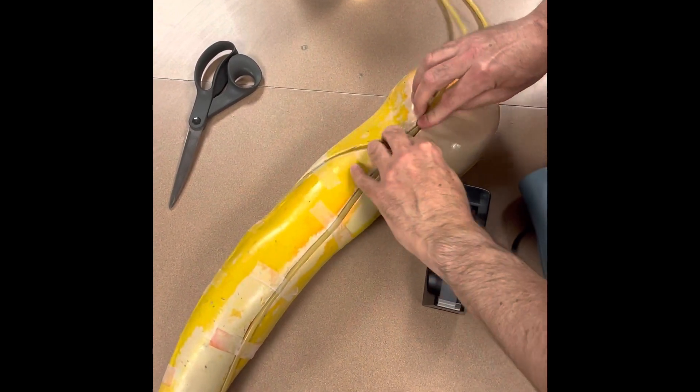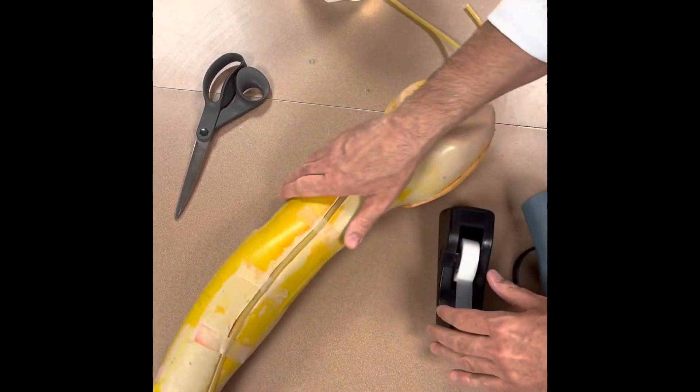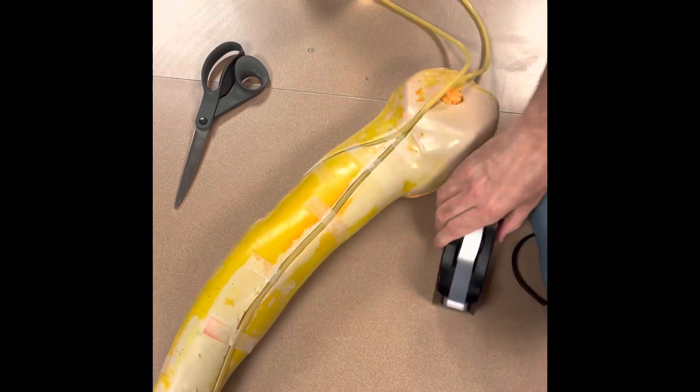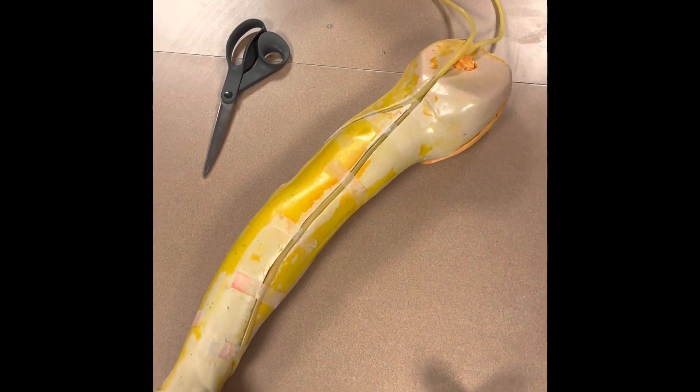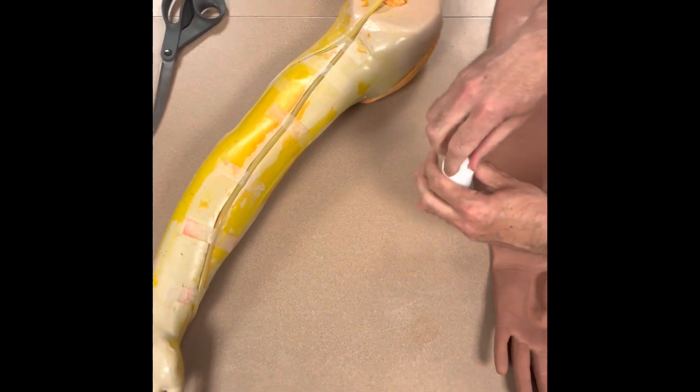Bring these two ends of the tubing together, and one more piece of tape up here to keep everything where it needs to be. Now we're going to grab our dish soap.